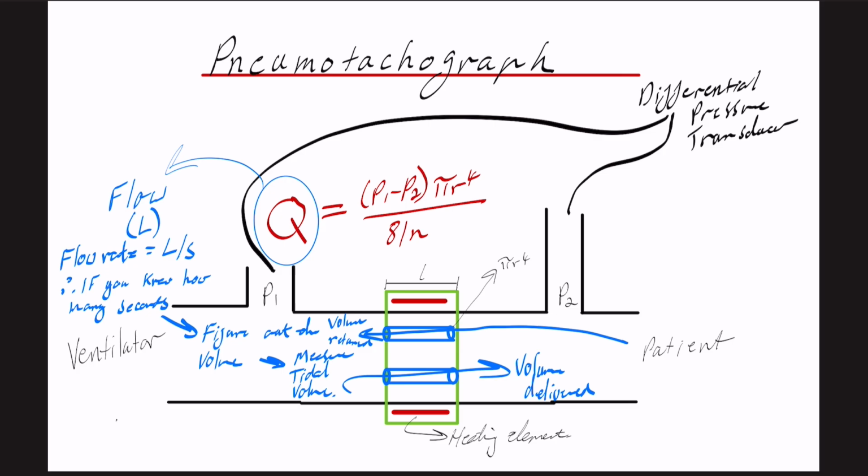So this diagram doesn't really represent a pneumotachograph in real life. It's purely here to try and explain the concept of a pneumotachograph. There's lots of different types of pneumotachographs, but this video is purely an explanation of the concepts behind how it works and how it's actually figuring out the flow.